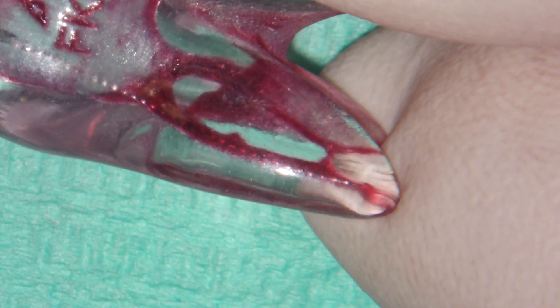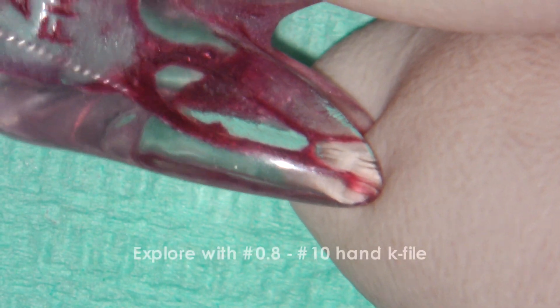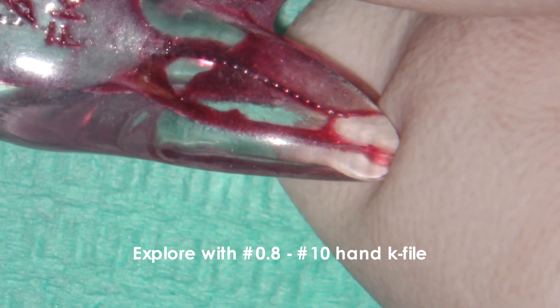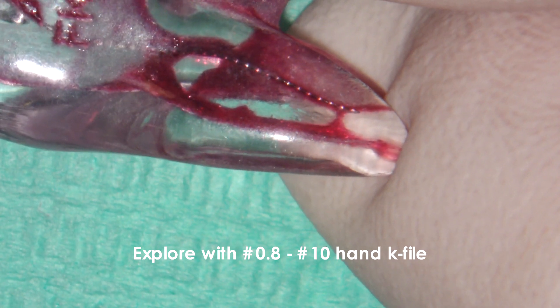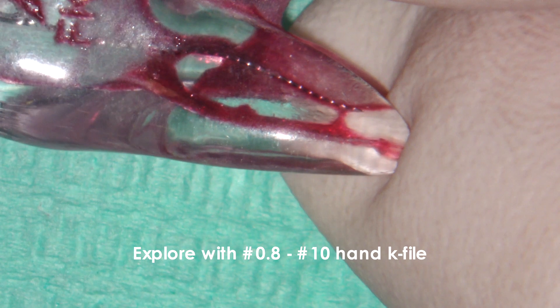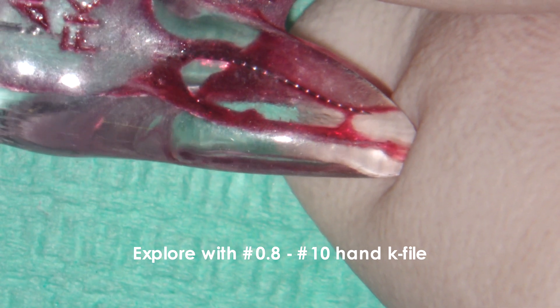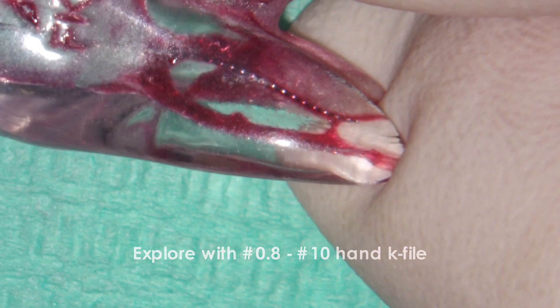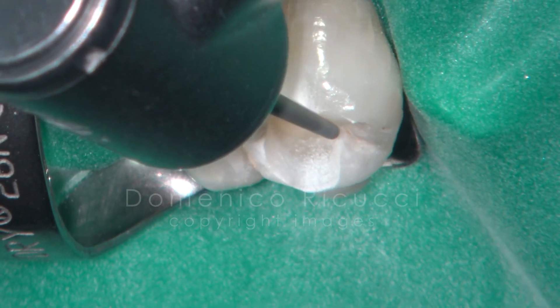Based on the approximate canal length measured on the diagnostic radiograph, explore the canals using an 08/10 file. Prepare stable reference points.